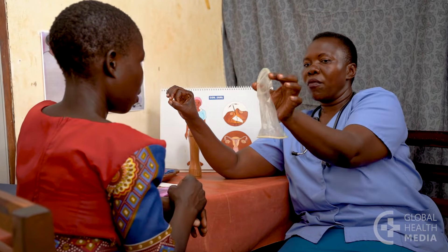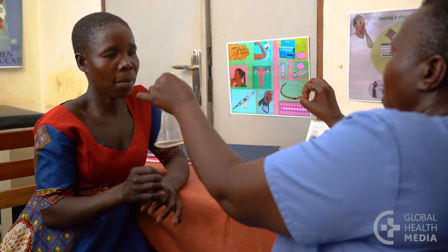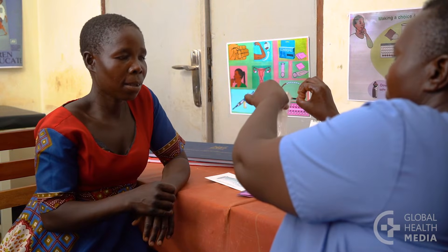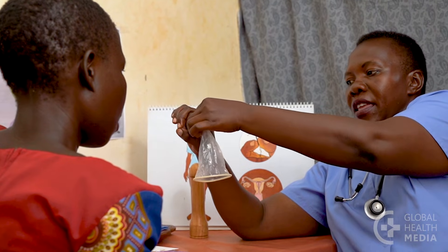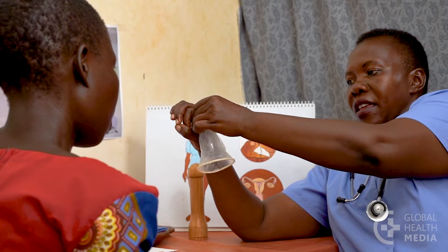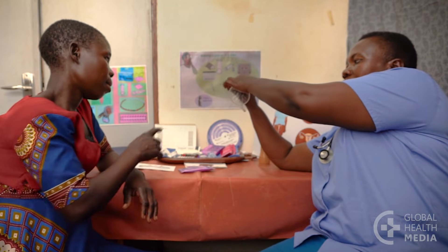Squeeze the ring together so it becomes long and narrow. The woman will separate the opening of her vagina and gently push the inner ring as far into her vagina as her fingers will go. The outer ring stays outside the vagina.